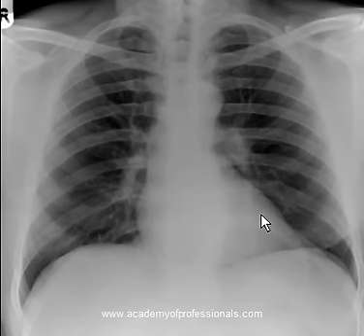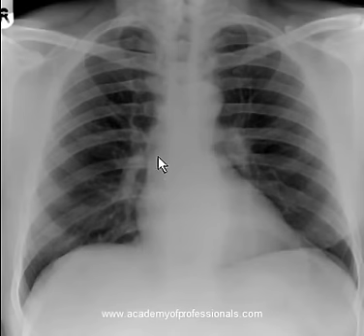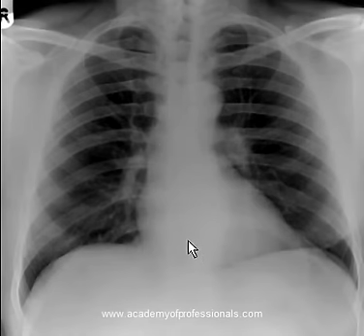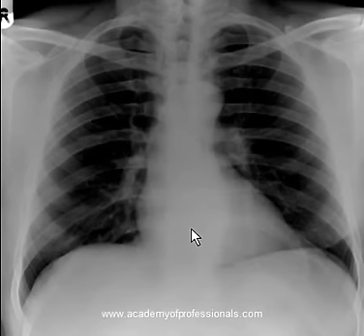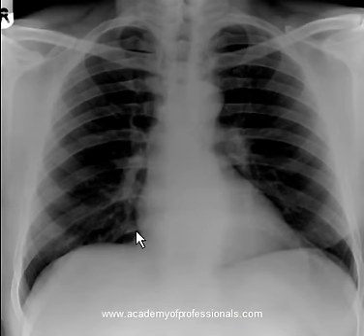The x-ray in front of you is normal and I want you to pay attention to mediastinal structures in this area. Normally you should be able to take a pencil and delineate or outline all normal structures.